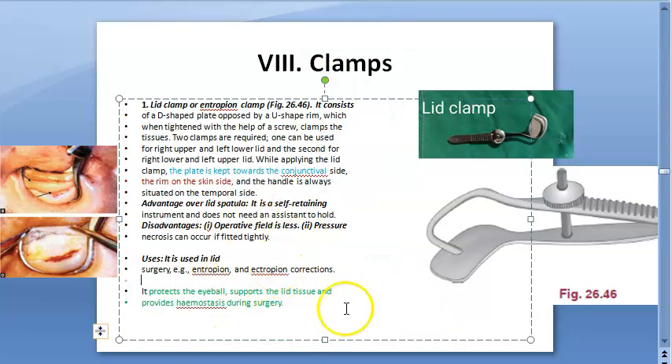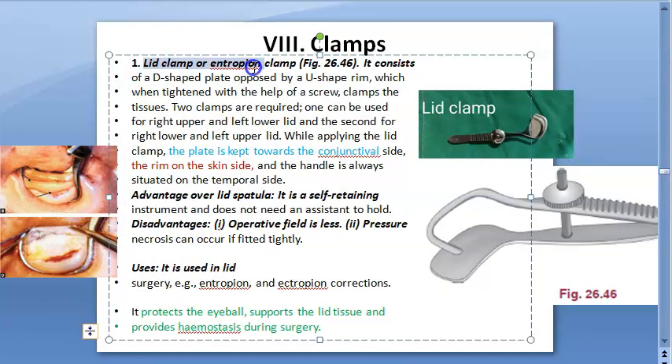Don't put it on too tightly, as it can cause pressure necrosis. So, you have now understood the lid clamp, or entropion clamp — the name itself says it all.